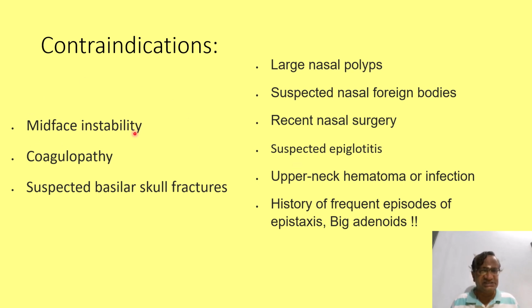What are the contraindications? Midface instability, coagulopathy, basilar skull fractures, large nasal polyps, suspected foreign bodies, recent nasal surgeries, suspected epiglottitis, upper neck hematoma, frequent epistaxis, big adenoids.